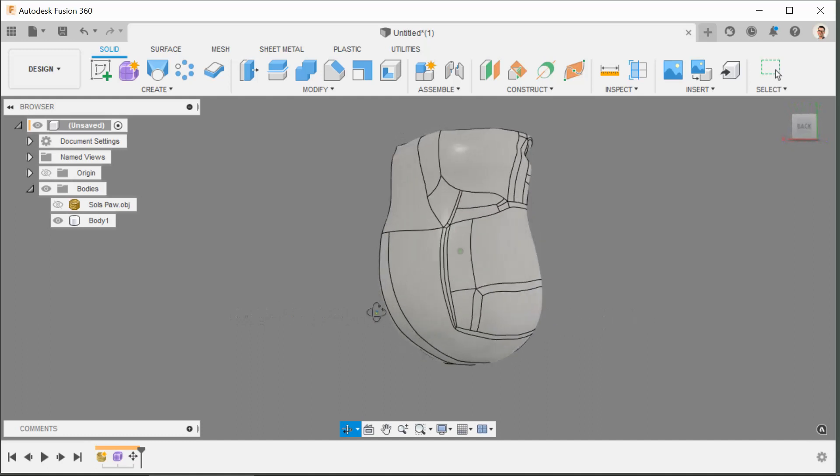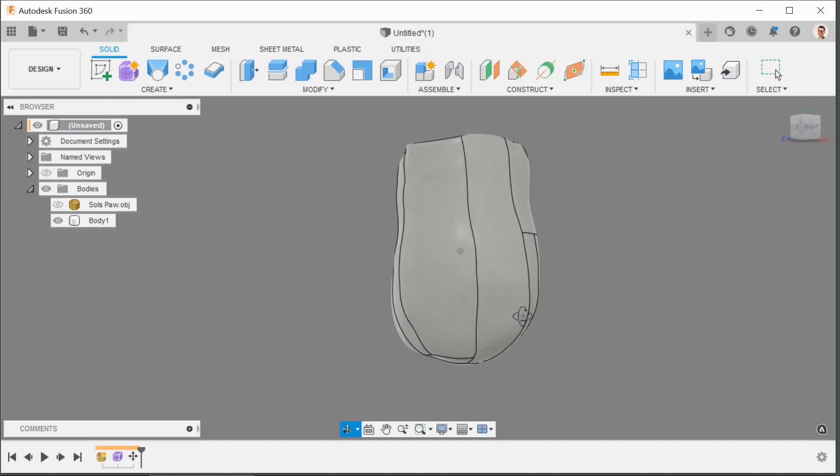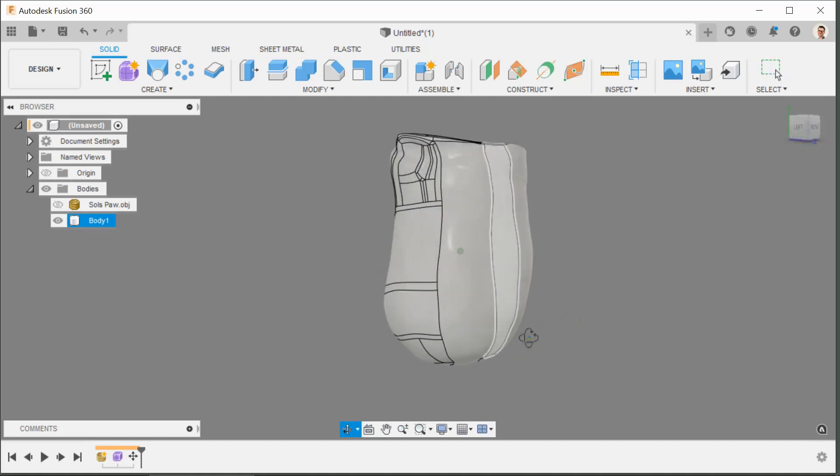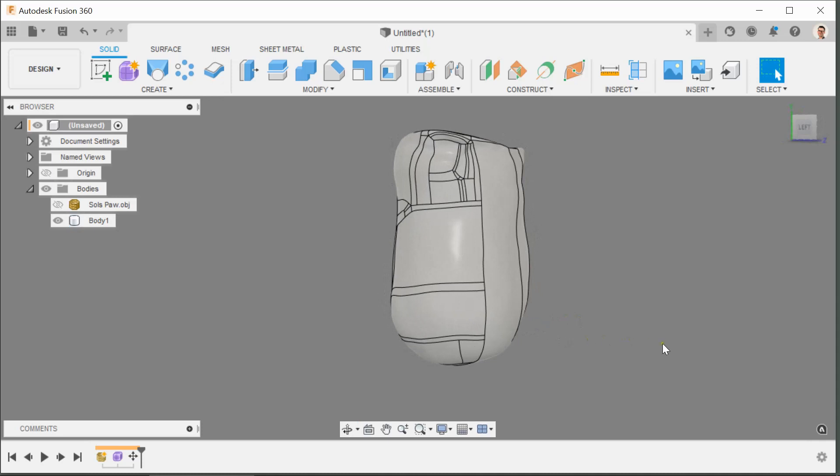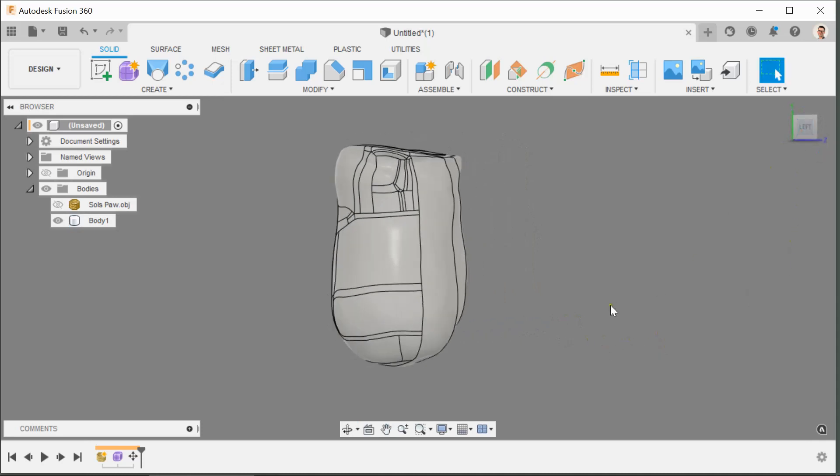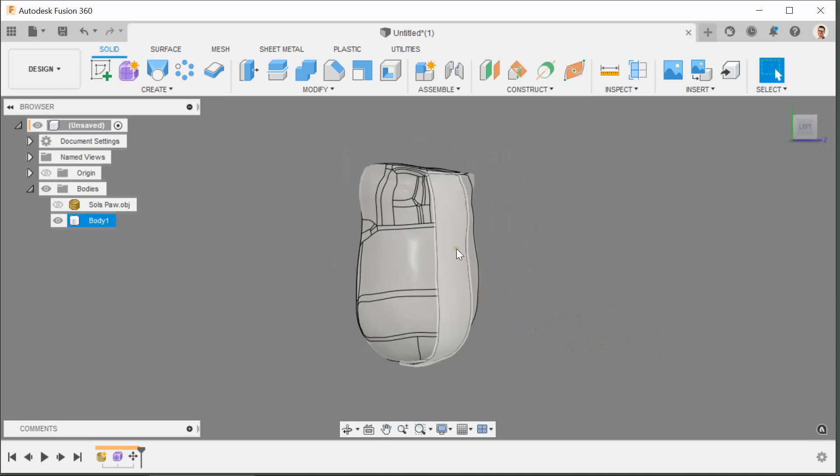But yeah that's now nicely aligned. So let's just recap on what we've done. You've got a copy of Sol's Paw, you're going to bring it into Fusion 360 using the insert mesh, and then you're going to use the method that I've just shown you to align it and get it facing the right way.